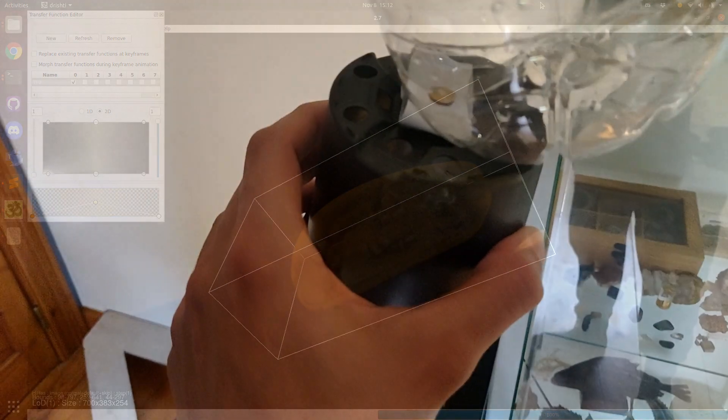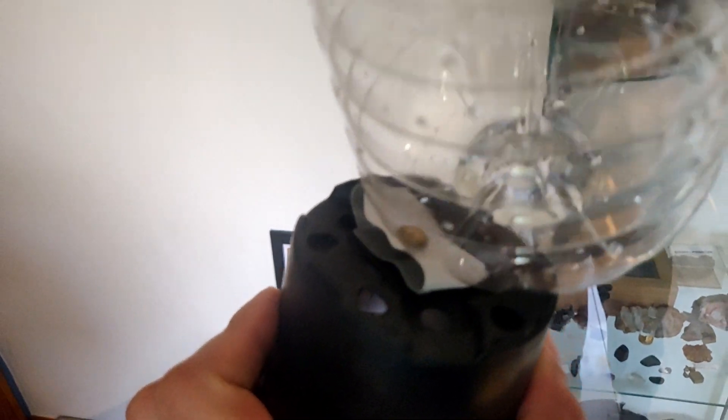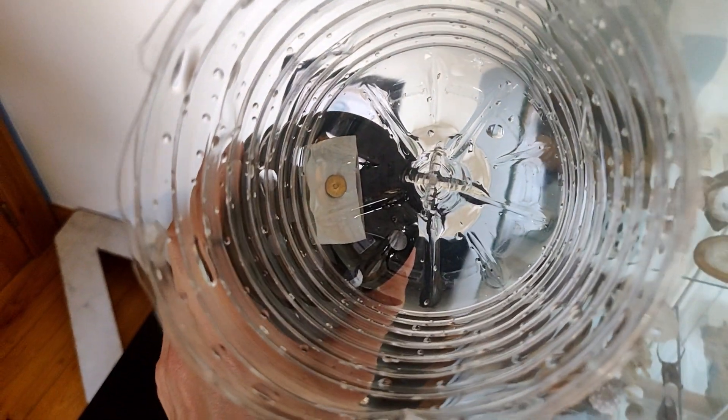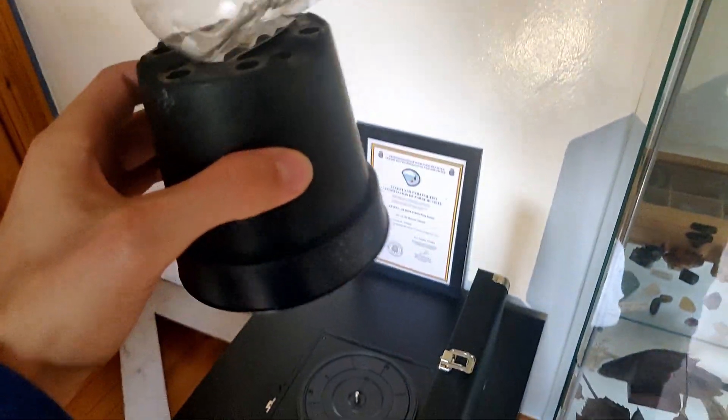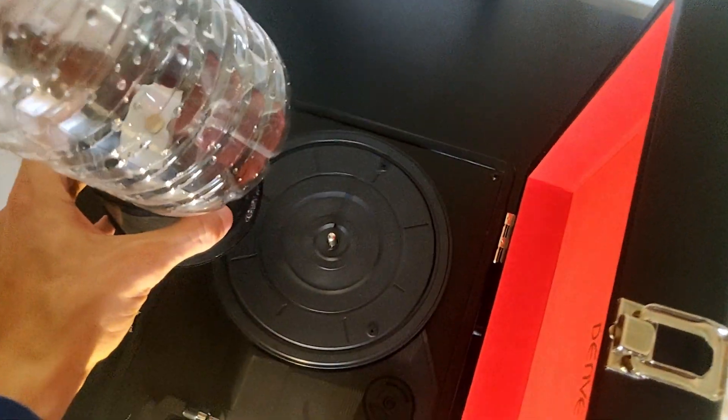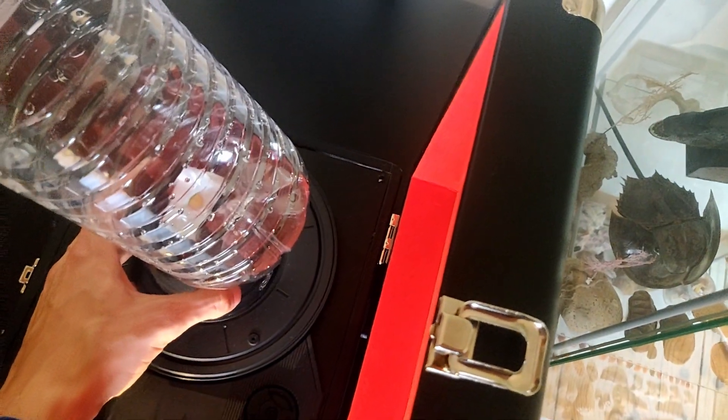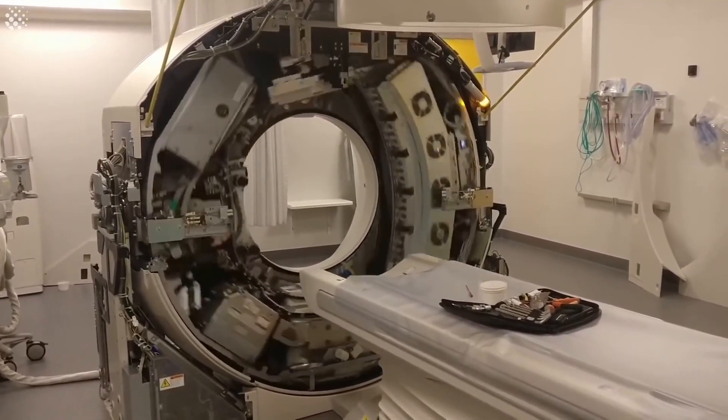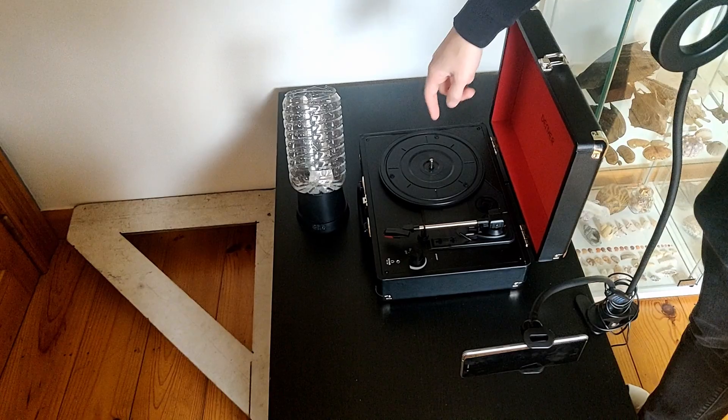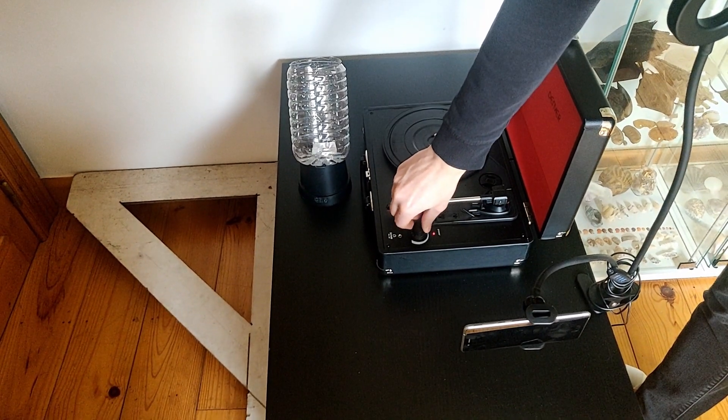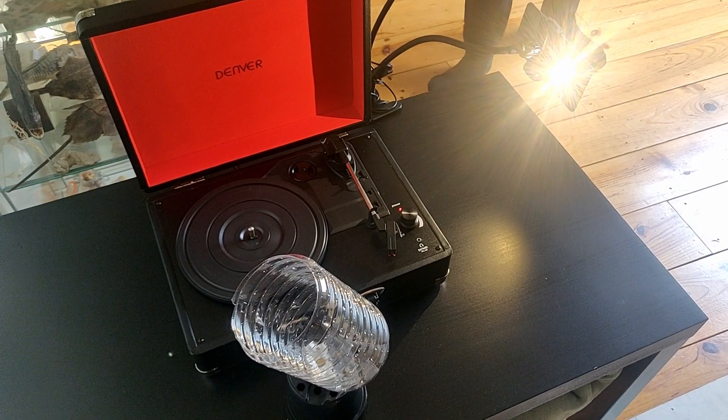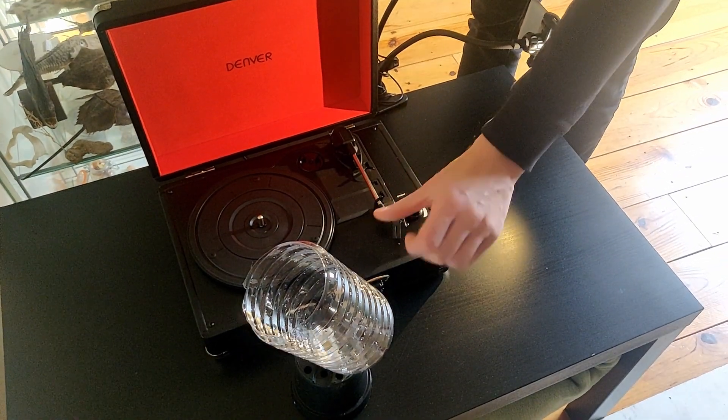Back home, we want to do the same thing but with visible light instead of x-rays. Therefore, relevant models can only be made from transparent objects. Instead of turning around the object like medical CT scans do to get every angle, we turn the object itself around to get every angle using a record player.